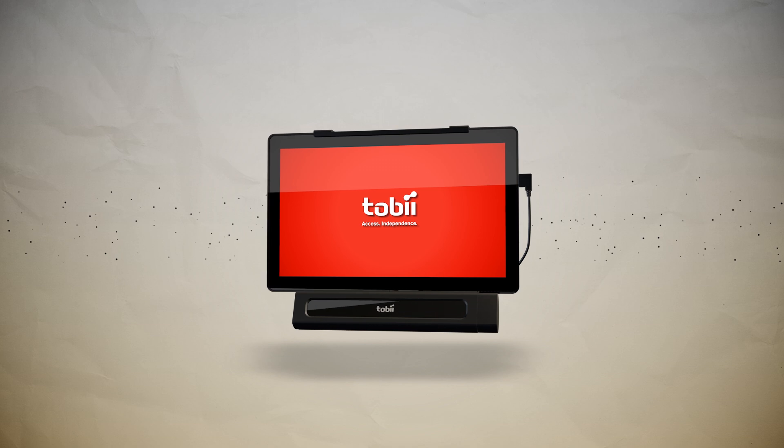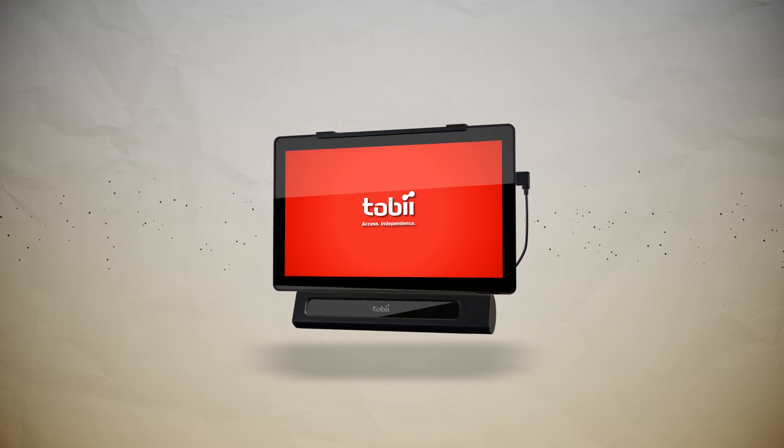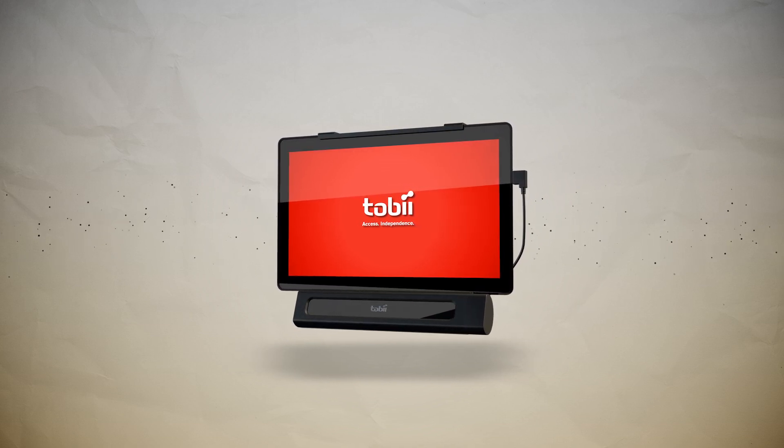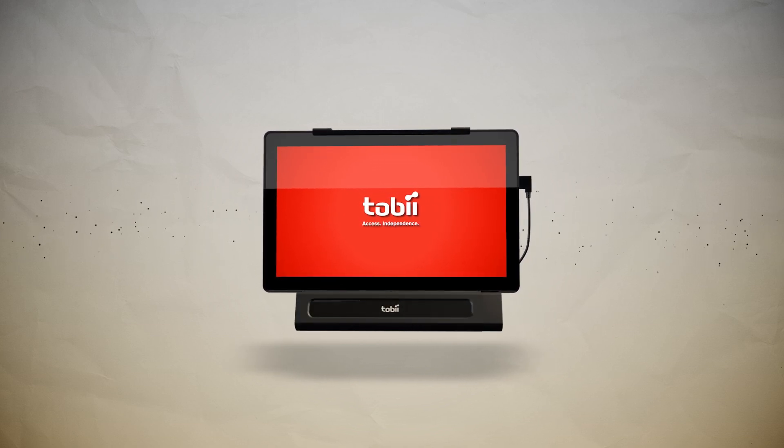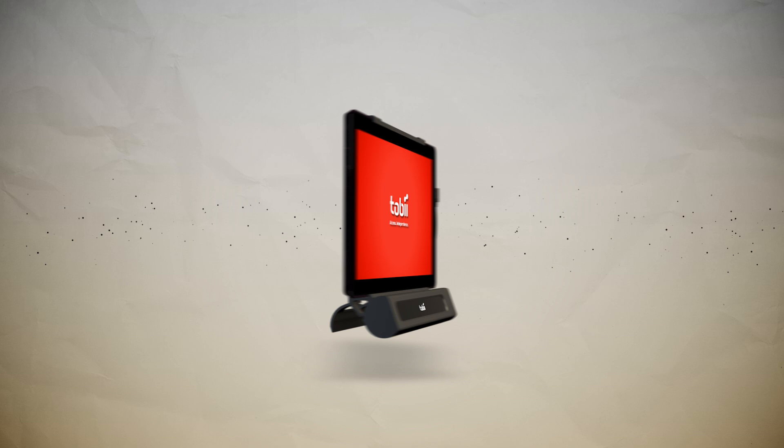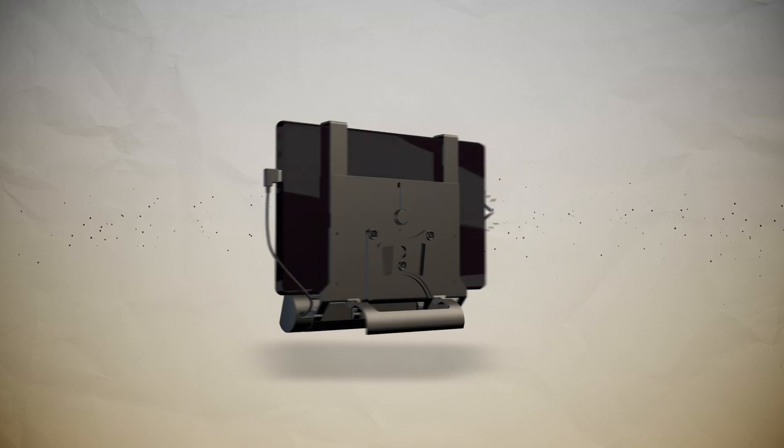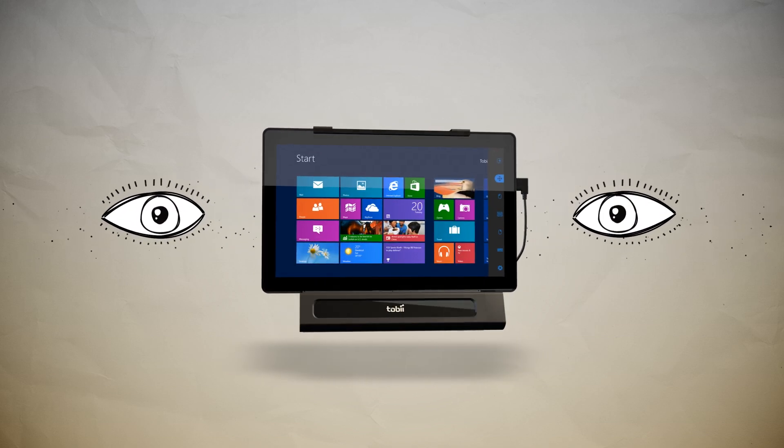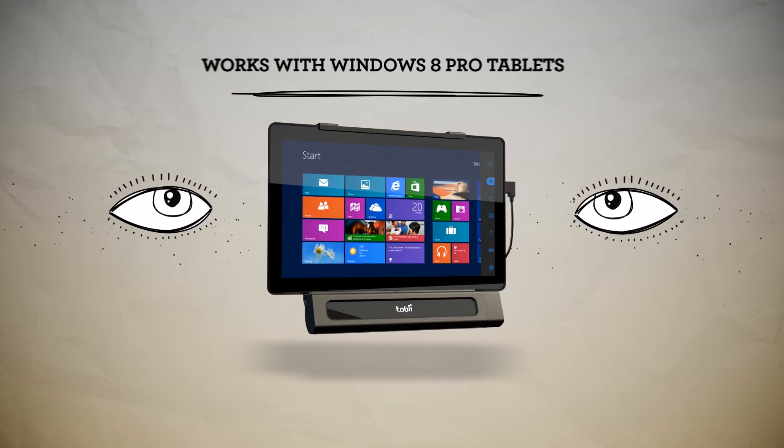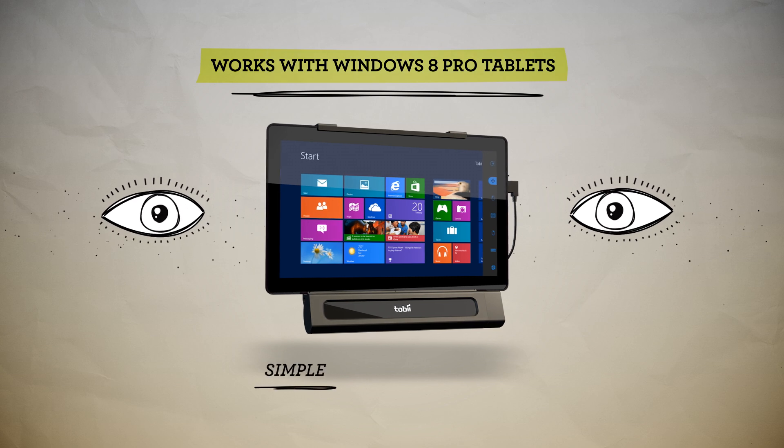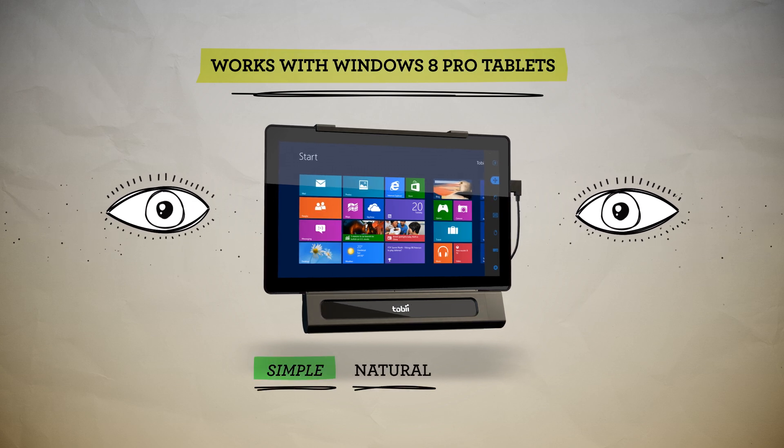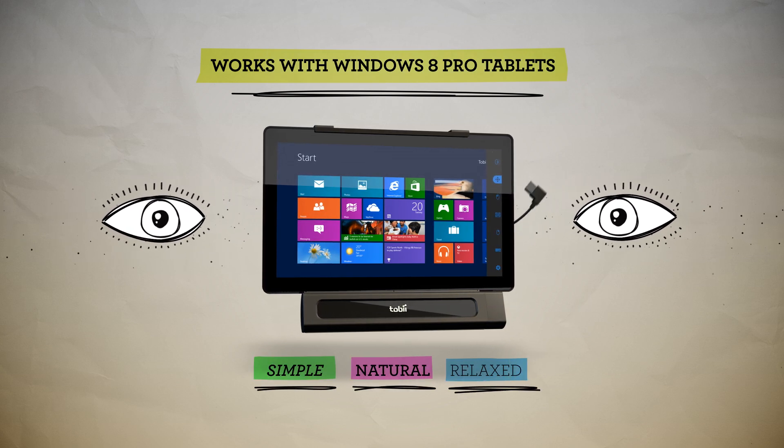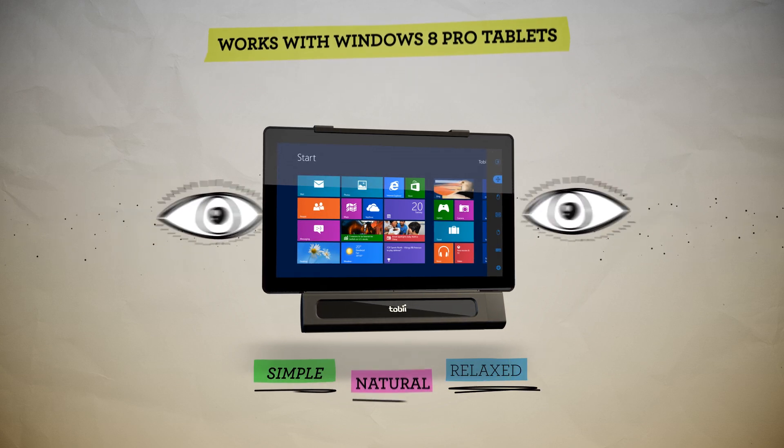It puts individuals with physical and communication impairments at the forefront of consumer technology, allowing them to navigate and control nearly any modern Windows 8 Pro tablet with the simple, natural, and relaxed movement of their eyes.